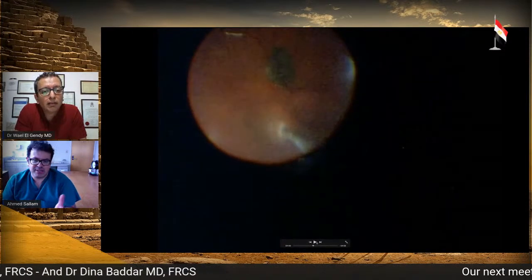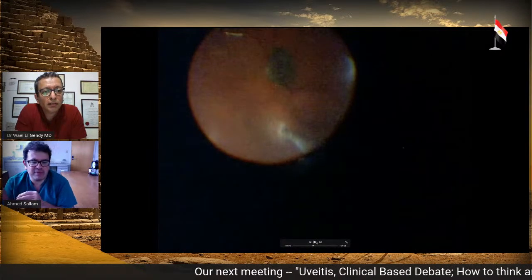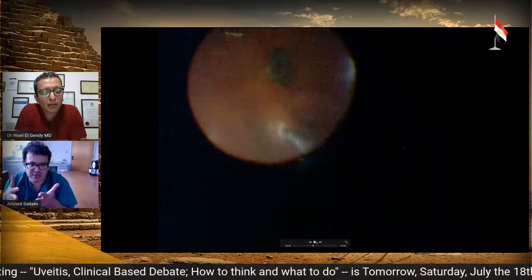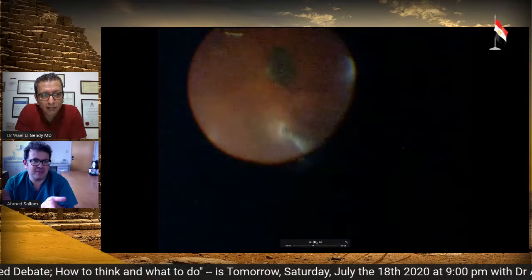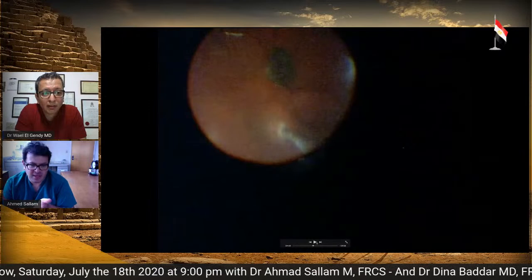It's a physical system. You're injecting the oil actively and you're passively removing the PFCL. So understandably, you're running into a situation where there's high pressure in the vitreous cavity. That's what happens. So can we do this actively? Yes. And that's another method.